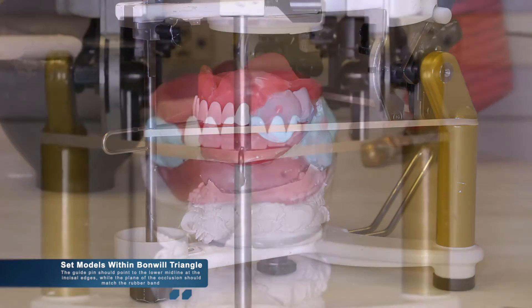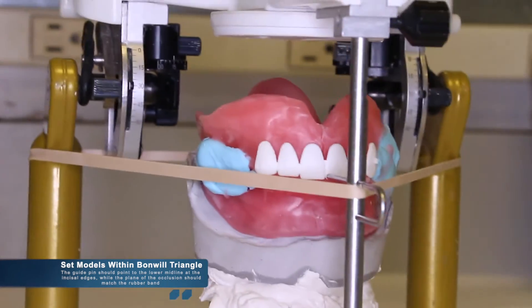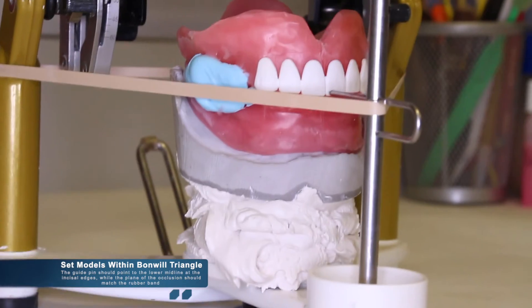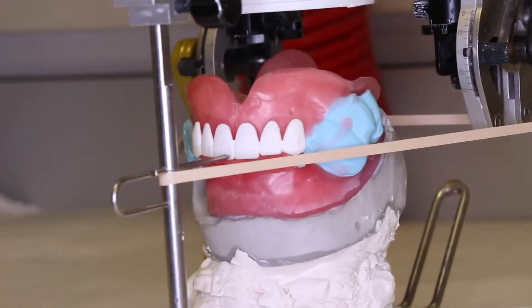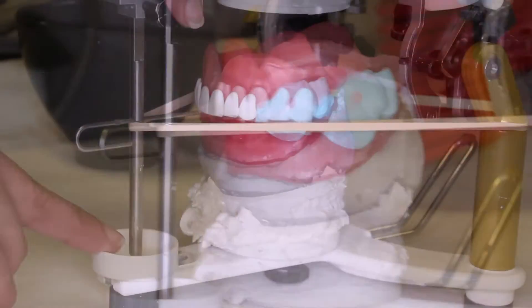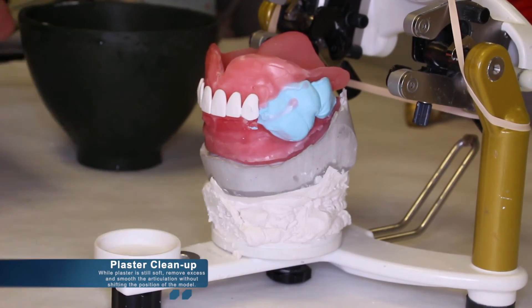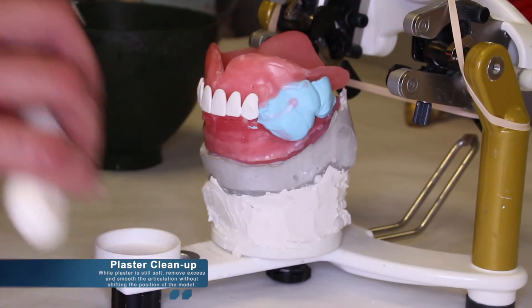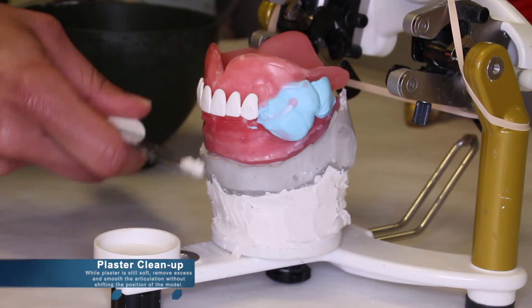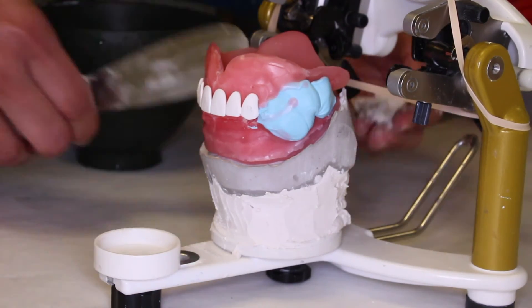The guide pin should point to the lower midline at the incisal edges, or in this case at the midline at the top of the occlusion rim, while the plane of occlusion should match the rubber band. Once the models have been positioned properly, we can then continue to clean up the plaster. While the plaster is still soft, you can remove the excess and smooth the articulation, taking caution not to move the models out of position.